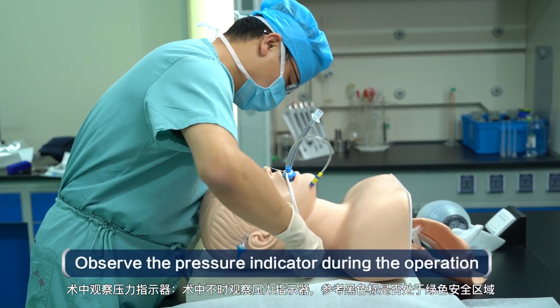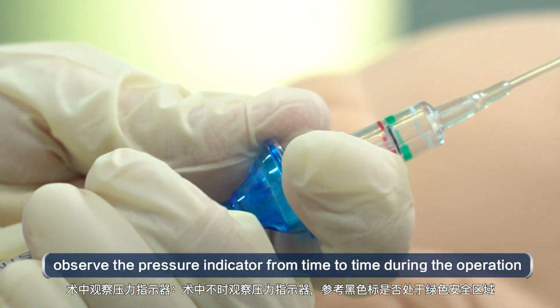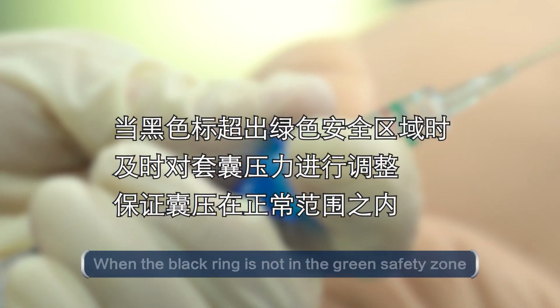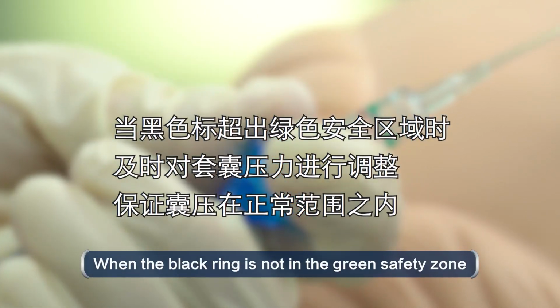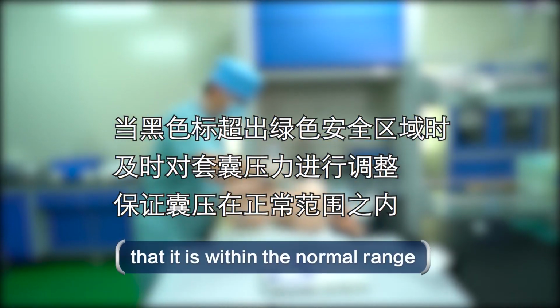Observe the pressure indicator during the operation. Observe the pressure indicator from time to time during the operation and check whether the black ring is in the green safety zone. When the black ring is not in the green safety zone, adjust the cuff pressure timely so as to ensure that it is within the normal range.